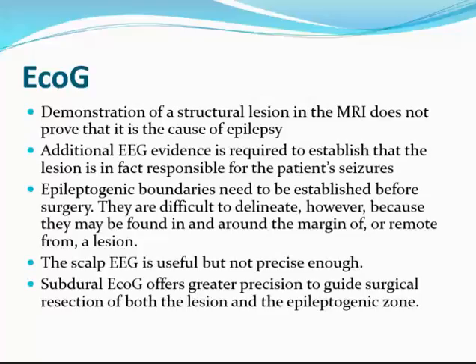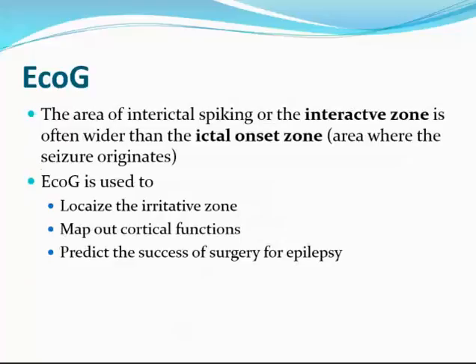Subdural ECOG offers greater precision to guide surgical resection of both the lesion and the zone that is causing the epilepsy. An ictal moment just means the beginning of a seizure and the end of it.